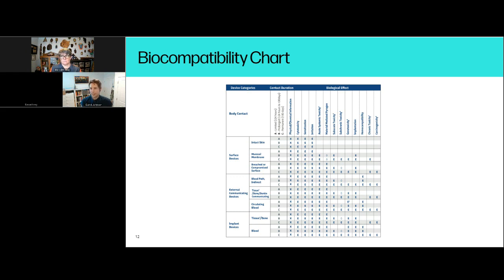Yep, totally understand. So we are wrapping up on the segment we were covering. We do have a few questions related to the biocompatibility side of it. The first was a question related to what you mentioned of looking at 510Ks and utilizing that. The question was that they're looking at a situation where it was the same device using the same material, same process, but a different vendor. Is that something where they can utilize the biotesting from that specific 510K, or would it be recommended to do additional testing just to cover your bases?